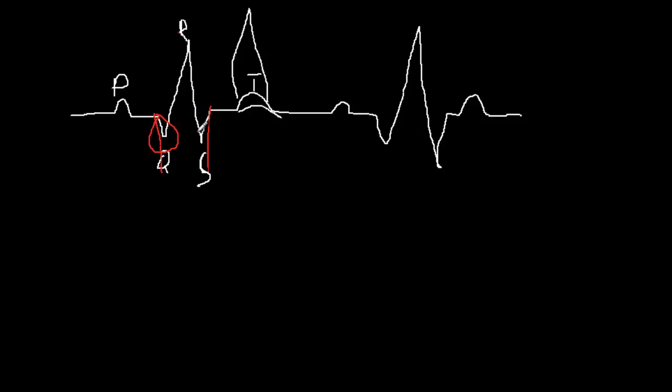So now I'm going to talk a little bit about the QT interval. So the QT interval is this. QT interval is a funky sign because it can indicate issues for sure. The problem is it's not 100%. And the reason why it's not 100% is that the QT interval will change as your heart rate changes. So the faster your heart rate, obviously, the shorter your QT interval, based on the way the physiology of the heart works.